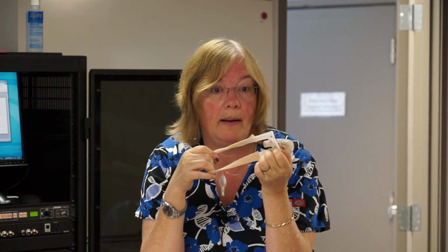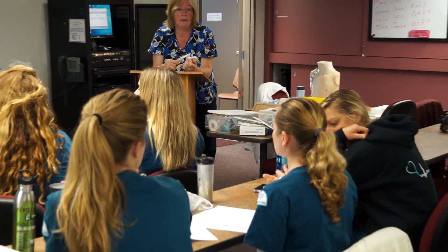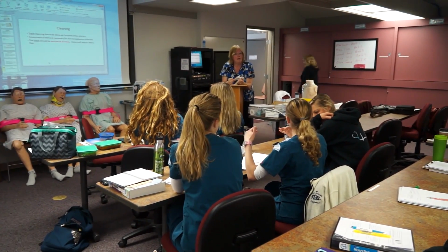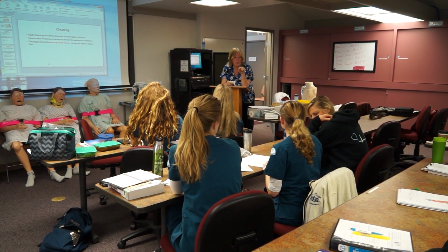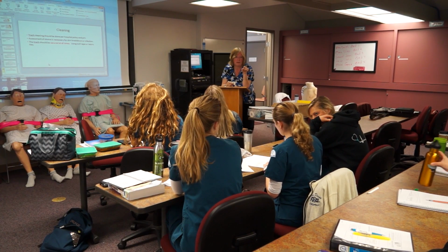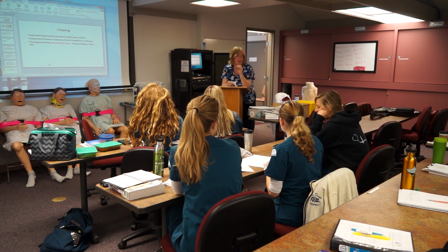Anybody else? I forgot about hyperoxygenation. So you give him 100% for how long, and how do you monitor? On the ventilator, there will be a little button on there that will say 100% O2, and it will automatically shut off after 2 minutes. So on your ventilators, it will always have a button on there that will say for suctioning.